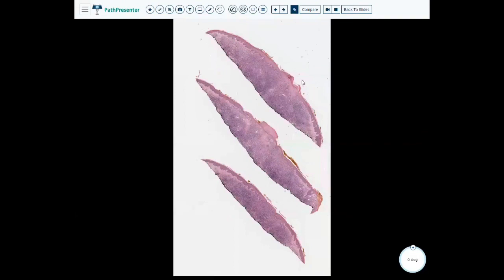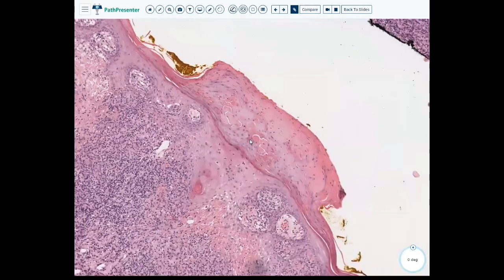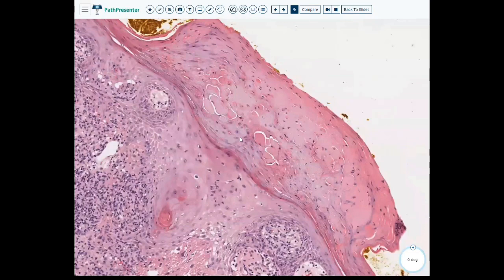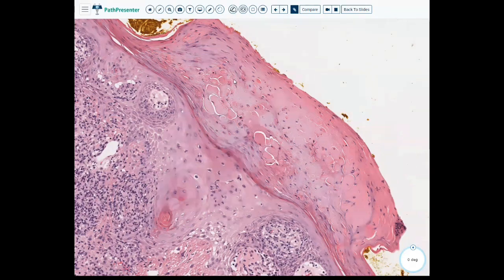The first thing we notice is that there's something definitely going on in the dermis — it's really blue — but there's also something going on in the epidermis. Focusing in, we see these big polygonal cells. This is acanthosis or epidermal hyperplasia. The nuclei, unlike some of the lesions we saw in the lecture, are very central. There is maturation where we start off with our basilar layer — here's our basal layer down here.